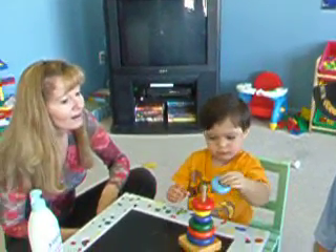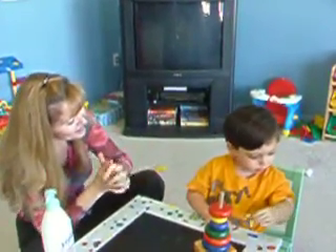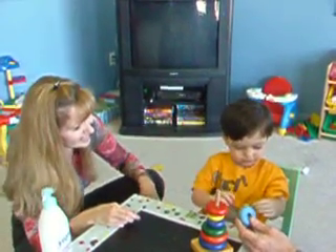Look, he's going to do it all himself, mama. All himself. Hey, wait a minute. Good boy. Very good.